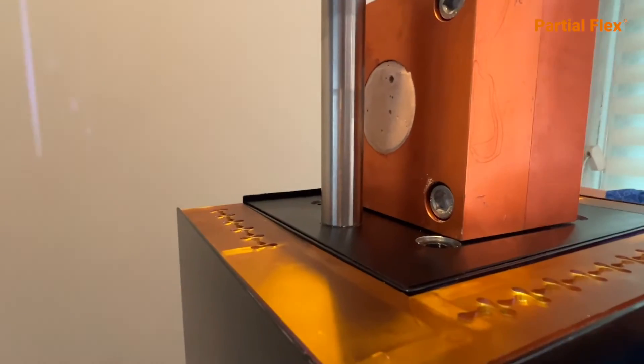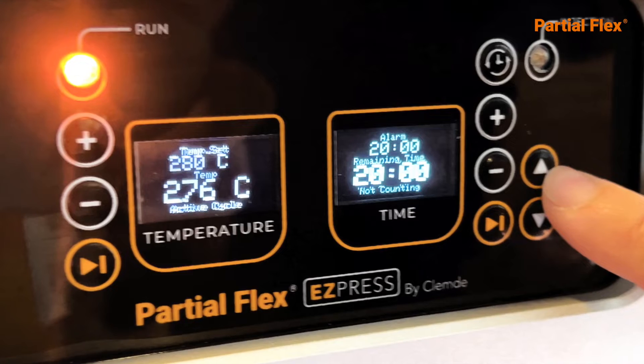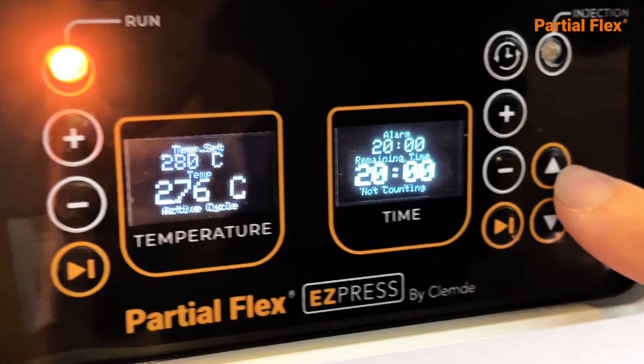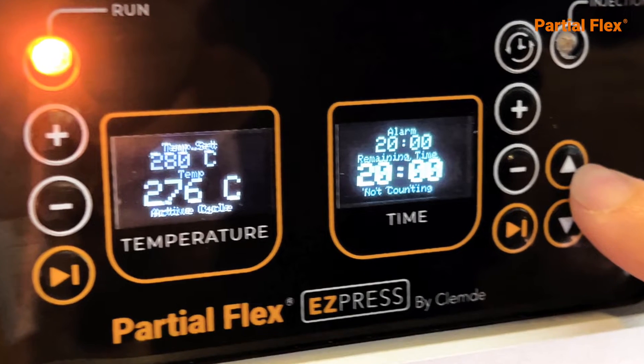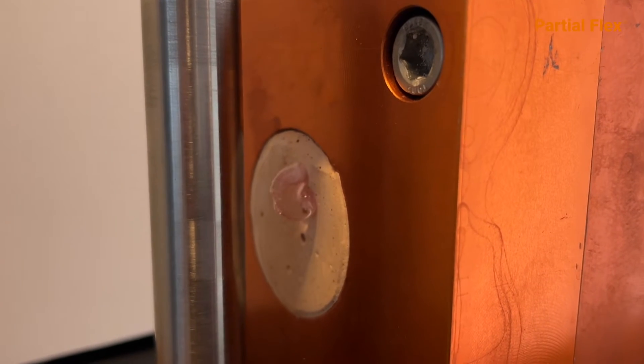Take care that the flask is in the proper position and secure it. Press the on button and after 30 minutes press the button to activate the injection. The material will start to flow from the chimney.